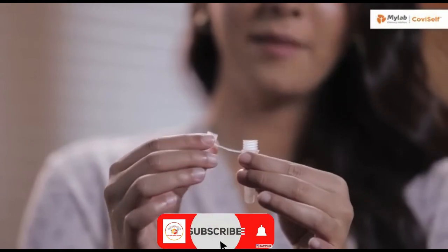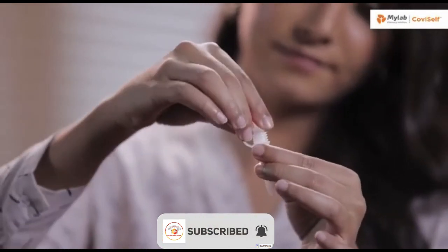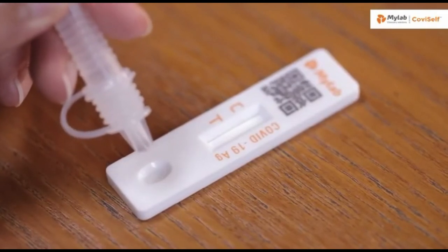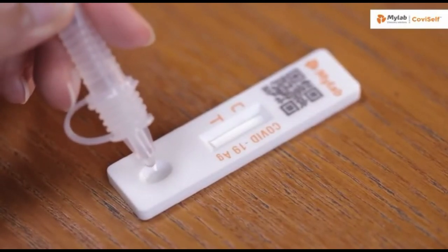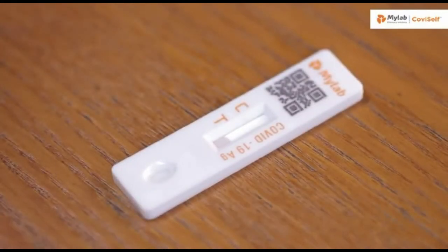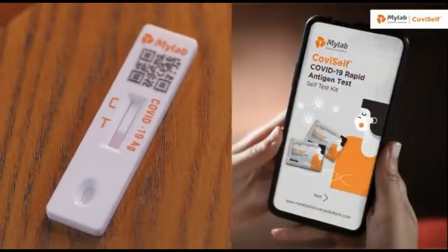Cover the tube with the nozzle cap and tighten it. Take the test card and add two full drops into the well by pressing the tube. Wait for 15 minutes for the results to appear. Any results appearing after 20 minutes are considered invalid.